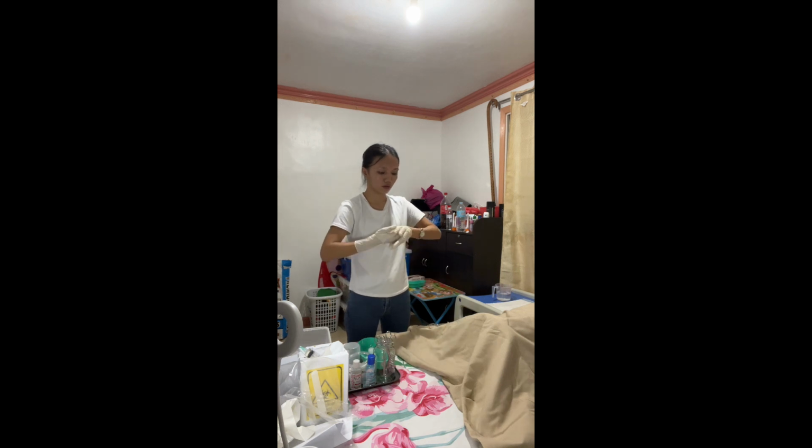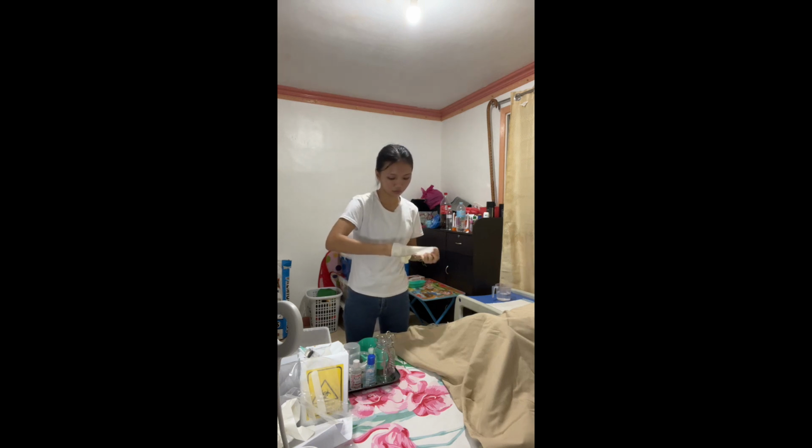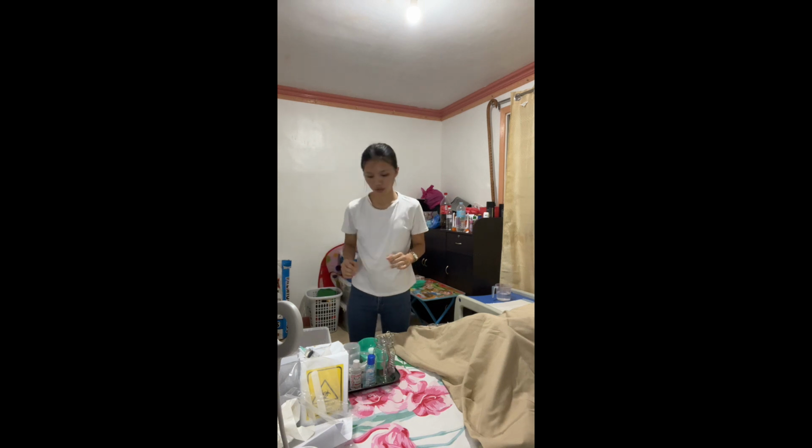Next, we are going to do aftercare and record the time of the procedure done, and the amount and color of initial output, for documentation purposes that the procedure was done and as a means of communication. So we are going to discard. And then we have to roll this up and perform hand hygiene.